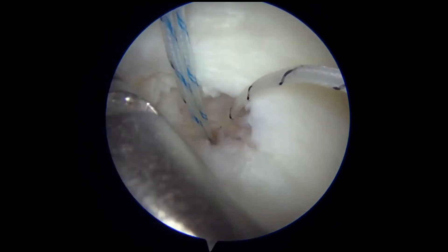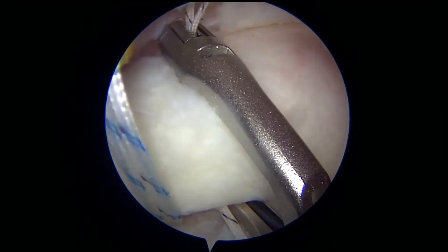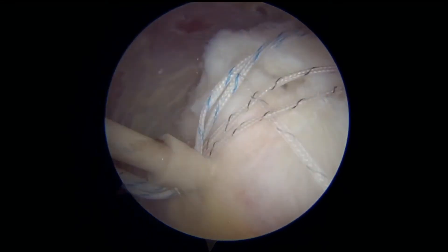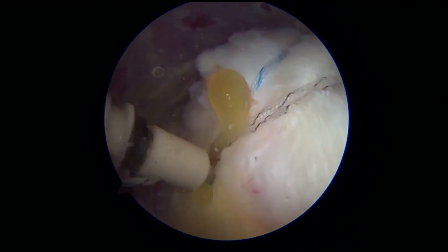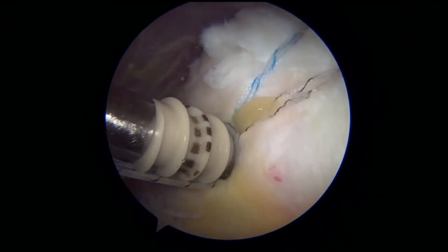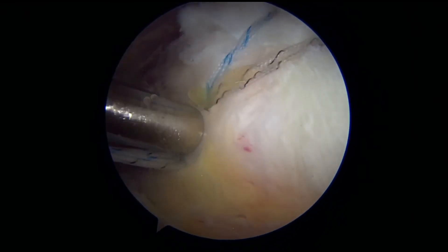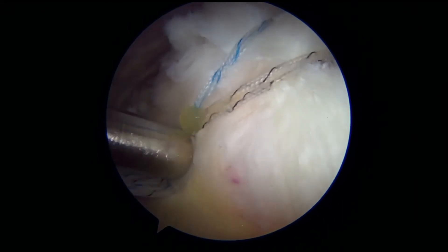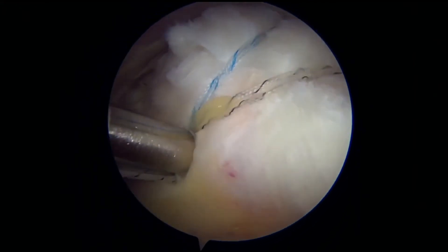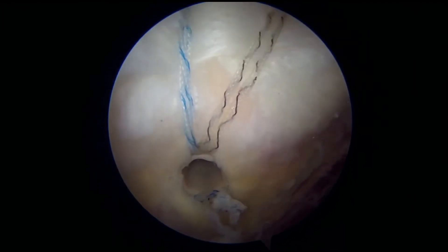That suture then gets woven into the tendon with a sewing device, which is visualized here. Once the sutures are placed through the tendon, they then secure the tendon across the top. In this case, there are four sutures total and they are placed into this plastic device which holds the suture into the bone. The suture is secured in two locations — one on the inner portion of the tendon and the other on the outer portion — which secures the tendon back to its normal anatomic attachment, also known as the footprint. You can see those four sutures squeezing the tendon up against the bone where it belongs, and you can no longer see the tear.